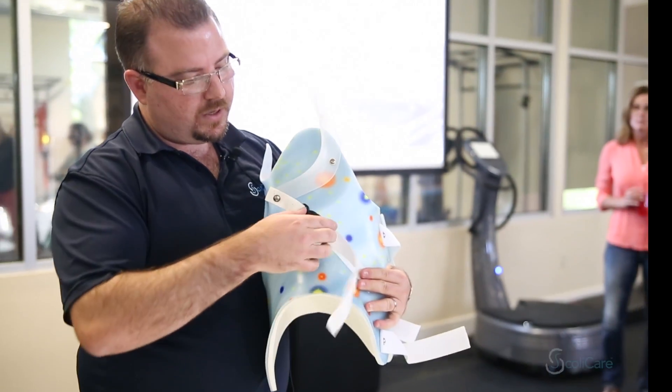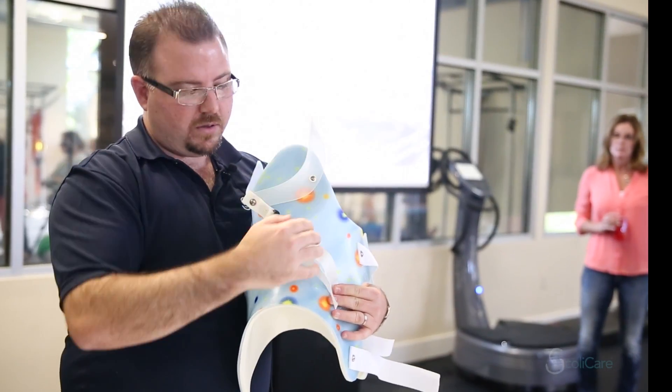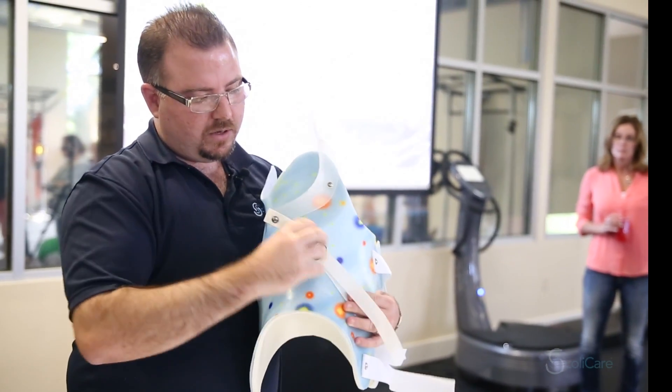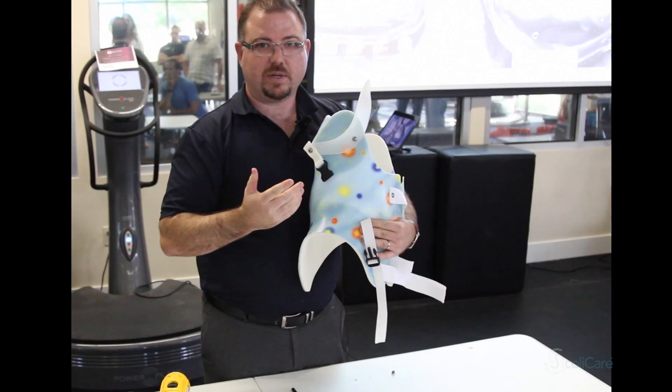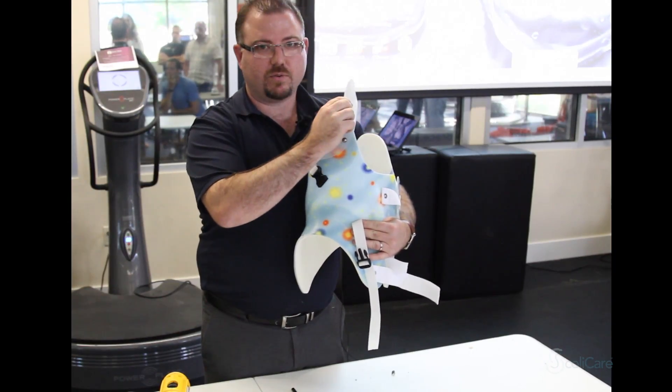Once that's locked into place the patient then has some options. They can release the tension here, which will allow the arm to swing, or they can maintain the tension and they can release the quick release buckle. That then keeps this at the tension that's required.